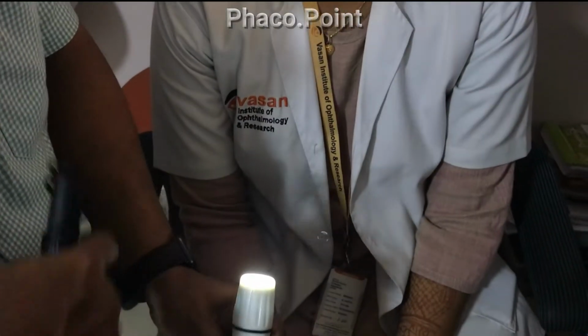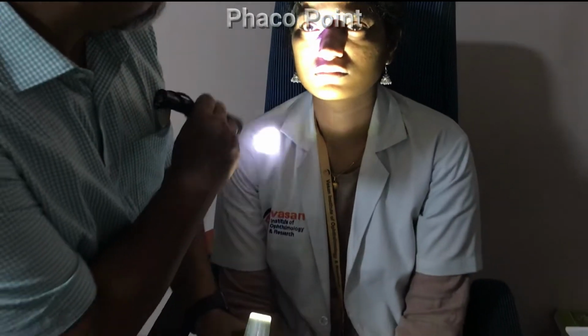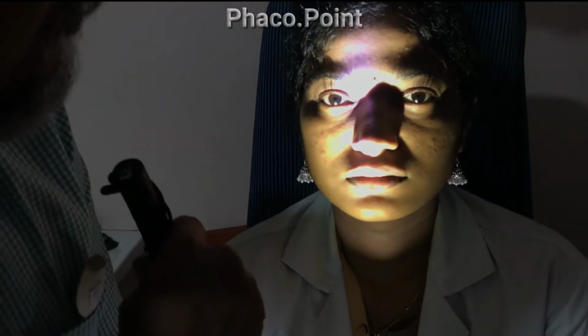Simple test. So in this case, I'm going to demonstrate how to elicit the indirect light reflex. So the indirect light reflex, or the consensual light reflex of the right eye, you have to observe the pupillary reaction on the left eye. So for this, you again bounce the light on from below. So hold the torch below so that the light bounces off the patient's nose and both pupils are illuminated. Okay, and then you shine the light on the right pupil and see what happens to the left pupil.